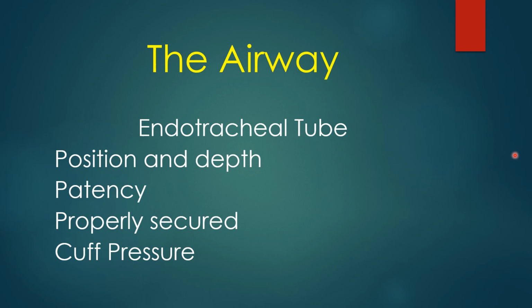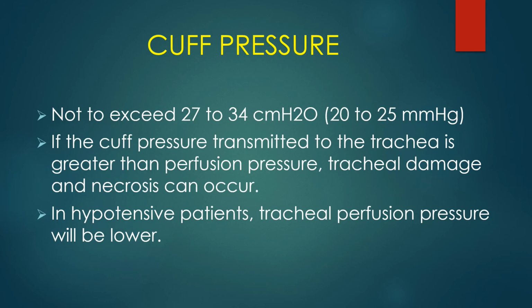Cuff pressure, we need to measure the cuff pressure. The cuff pressure can cause the patient to have tracheal damage if the pressure is too high. If the pressure is too low, you have leaking some of his tidal volume out.